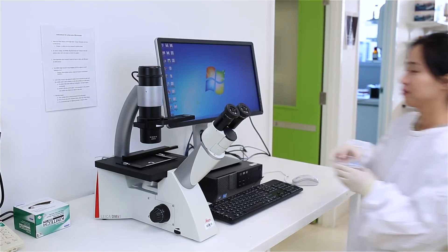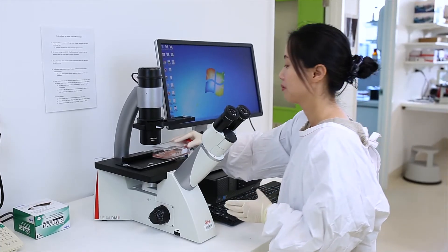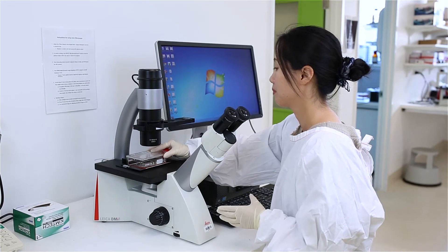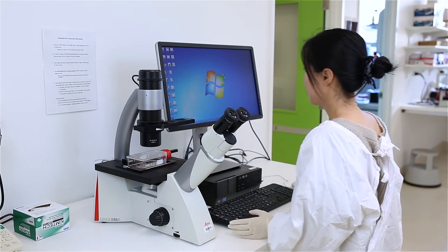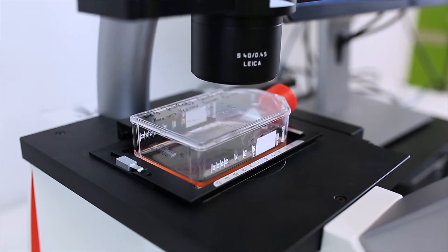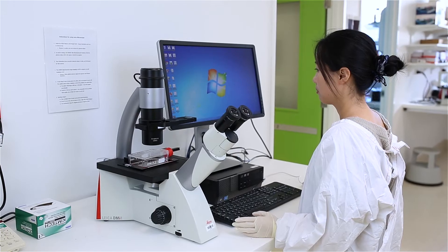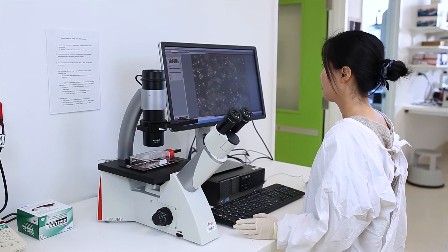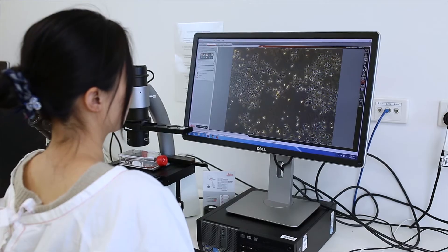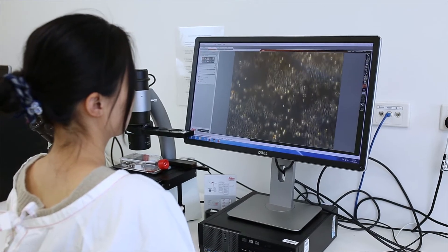Once the cells become highly confluent, meaning they have grown to a point whereby they cover the entire surface of the culture vessel, the cells can be harvested via enzymatic manipulation.